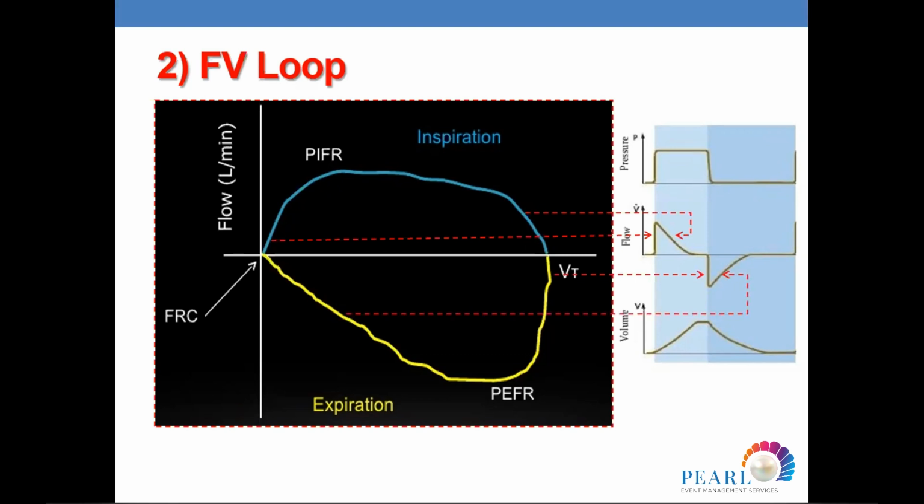Another way, actually, according to the other side, yes. So the best, thank you, Dr. So the best ventilator is the ventilator which you know.